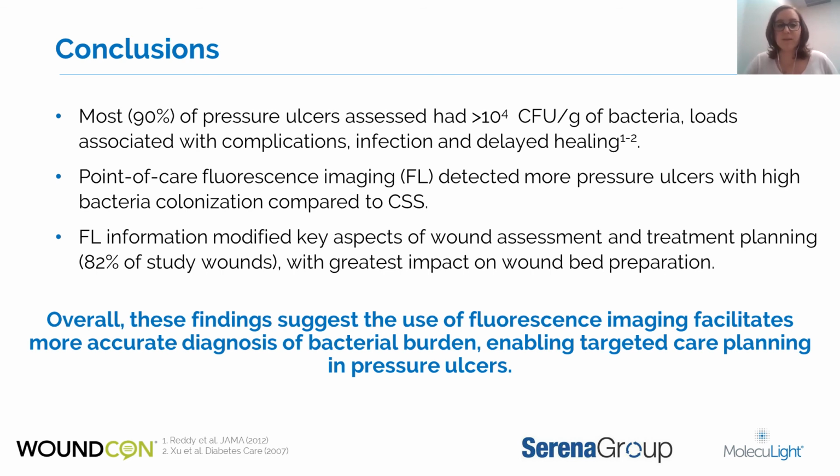Overall, these findings suggest the use of fluorescence imaging facilitates more accurate diagnosis at the point of care for bacterial burden. It enables targeted care planning in pressure ulcers, a wound type in which bacterial burden is often undetected and therefore unaddressed.